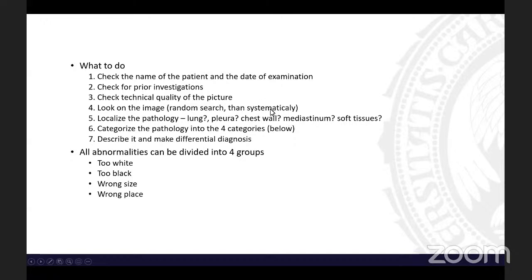When we find something that is pathological, and that's actually a really big sentence that I told right now, because to tell that something is pathological is actually the most important thing on any X-ray. To recognize something that is not normal is the hardest thing you have on X-rays. The good thing with medical students, when they are examined, is they usually get pathological pictures. When I give a student a physiological picture, that's the worst thing I can do. But when you are in praxis, you need to know what is normal, which is actually the main thing anyway.